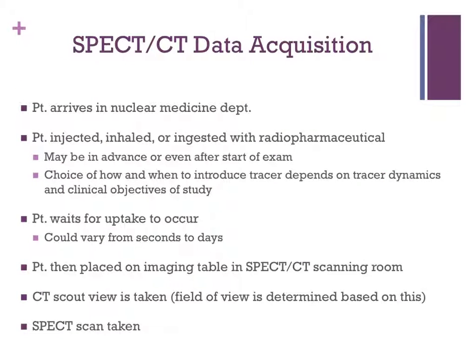We will discuss a basic procedure for a SPECT CT scan, but certain aspects may vary from patient to patient. First, the patient comes to the nuke med department to be imaged, and depending on the specific procedure, the radiopharmaceutical might be injected, it could be inhaled, or it could even be ingested in advance of the patient's appointment time, or even after the exam has been started. The time between the administration of the radiopharmaceutical and the imaging could vary from seconds to even days. The choice of how and when to introduce the tracer depends on tracer dynamics and the clinical objectives of the study at hand.